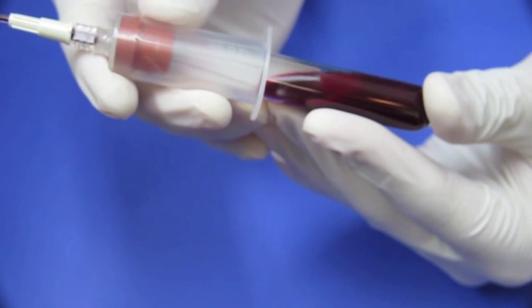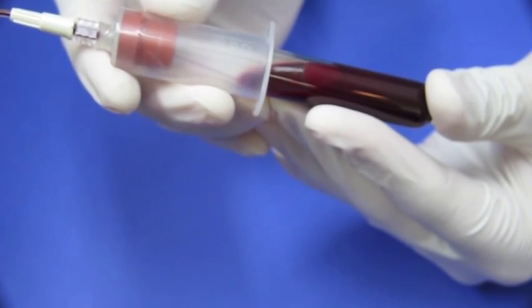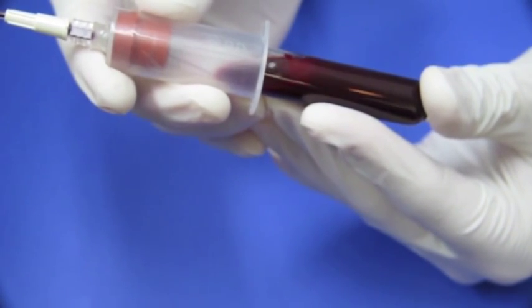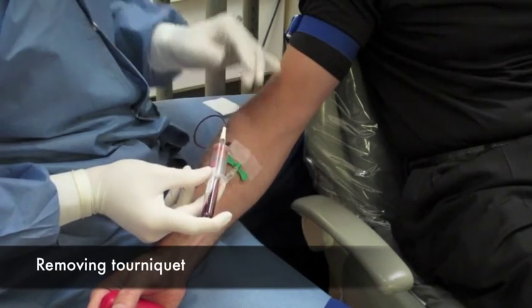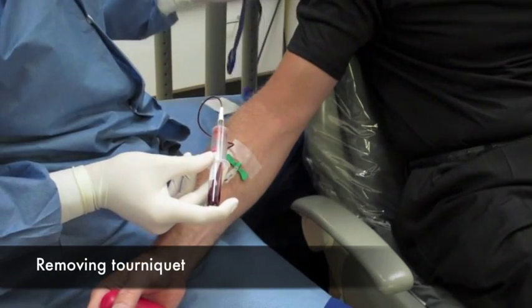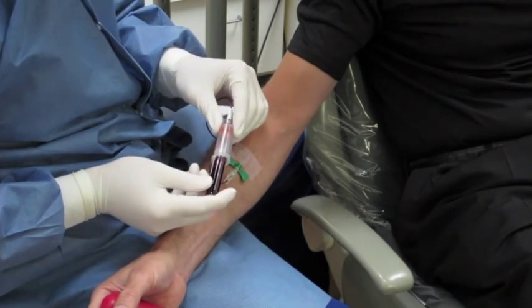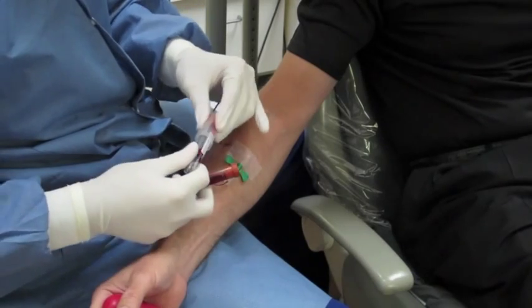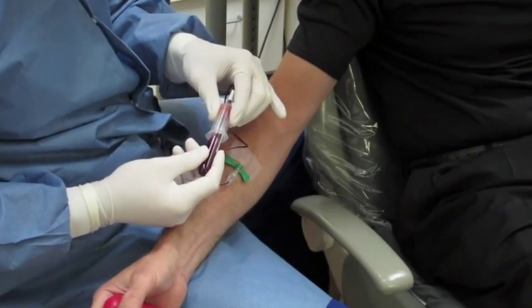As you begin your blood draw, place the tube so you'll fill from the bottom to the top, allowing you to follow the stream of blood as it enters the vacutainer tube. The stream will eventually get less and less as the vacuum diminishes, and then you'll know that tube is complete and can move on to the next. The tourniquet can be removed at the beginning of the blood draw, as you won't need it any longer — it was just to plump up the vein.